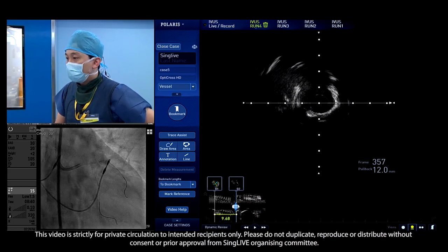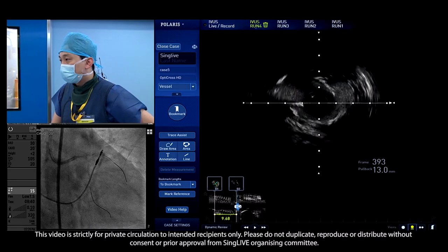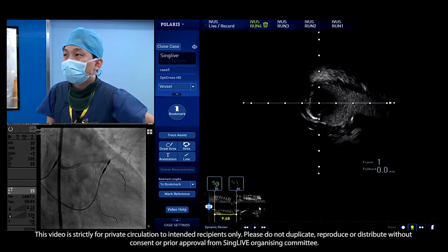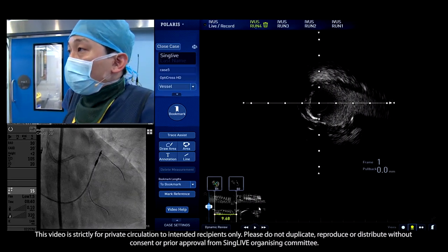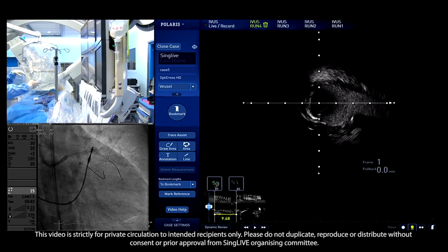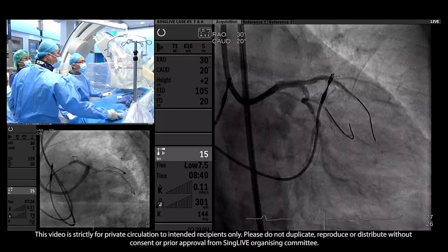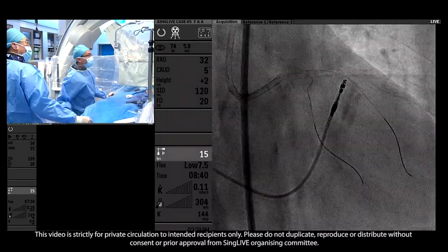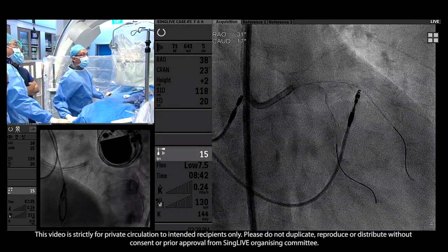But you did surprise us just now. The 2.0 balloon did open nicely. So maybe you can surprise us again. Yeah, we continue the surprise and winning streak. Shall we just stent left main to LAD as well? Then which technique will you use? Could you check the angiogram again? There was some hematoma, and we can go to the LAO cranial, or maybe both cranial. Okay, got it. If a hematoma extends to left main, we require full coverage of the left main. Okay.